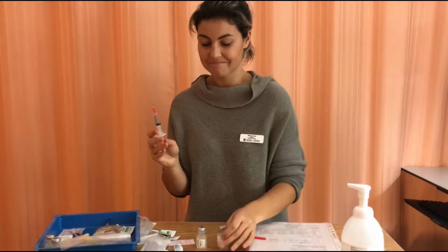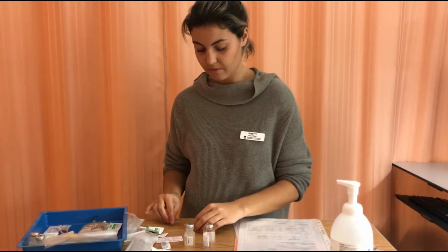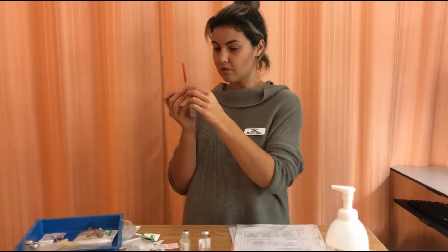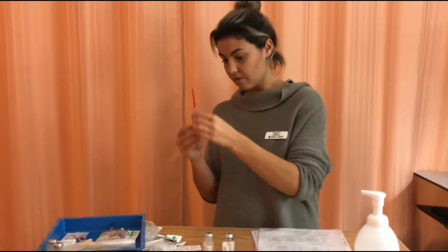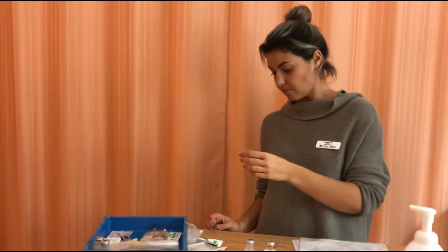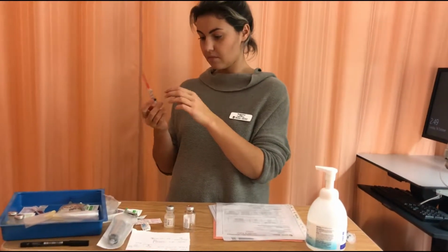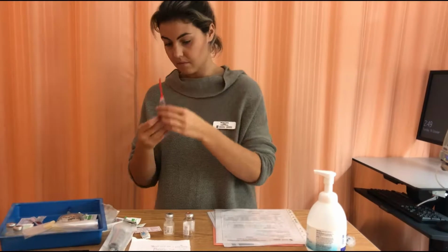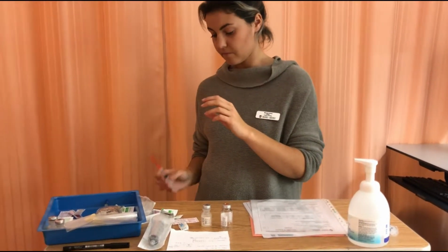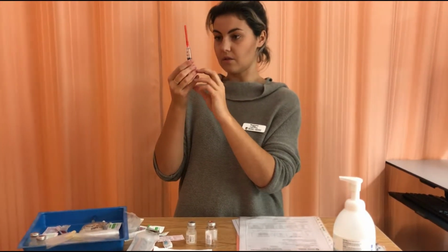So now I'll do my second check. I'm going to be demonstrating tapping. Right drug is penicillin. Making sure there are no bubbles in there. Compared my mark. And the right dose is 1 gram, route is IV, and frequency is every 6 hours, which is now. So our patient is Emma Wrightson. Okay. She is allergic to morphine. Again, I would be doing this over the sink, okay?